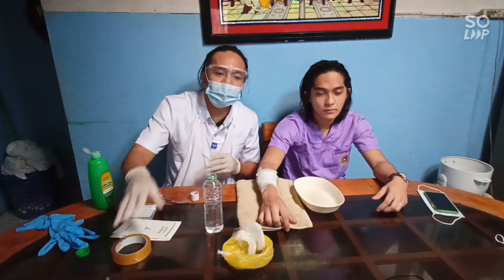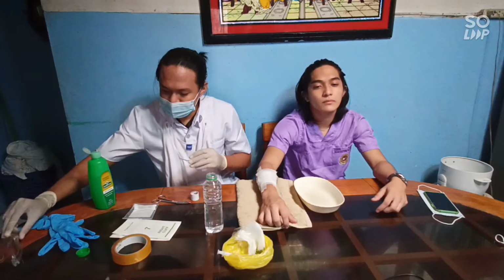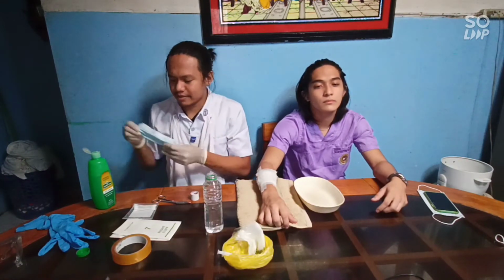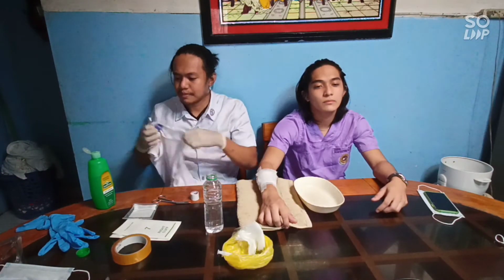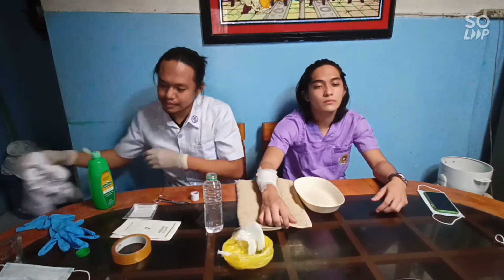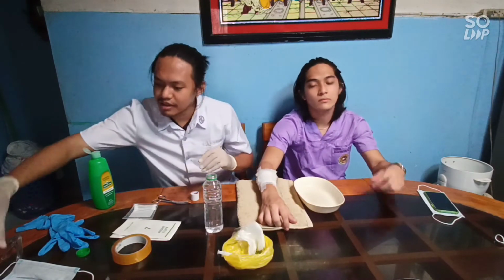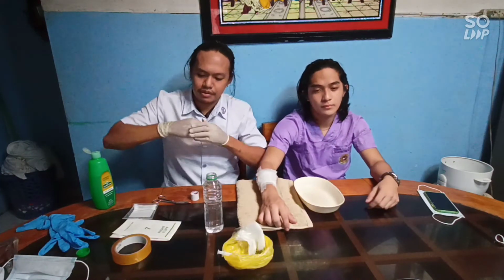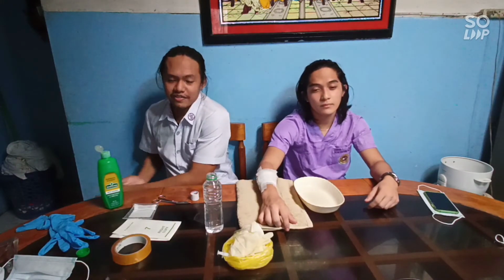Then after is to remove mask, goggles, and gown. Mask, then gown. Then dispose of the equipment and soiled supplies, remove gloves, and perform hand hygiene. Perform hand hygiene once again to deter the spread of microorganisms.